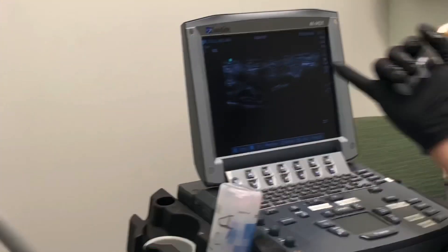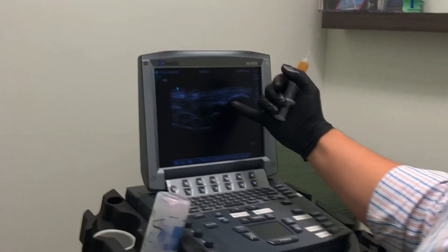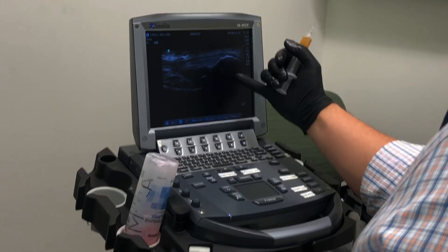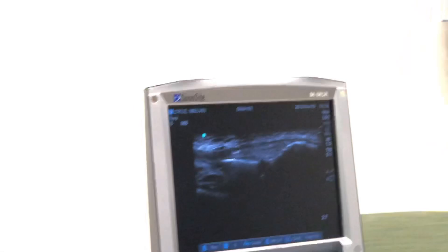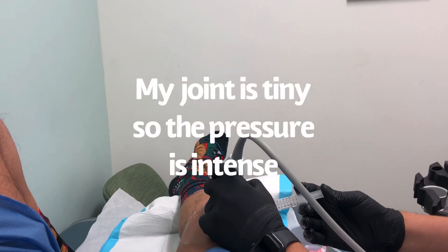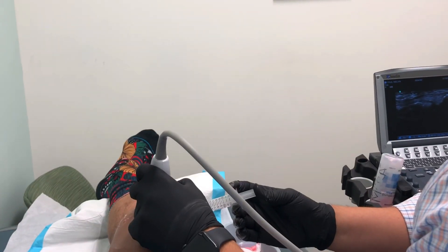There's a space right there — you can see there's some fluid in the joint. It's a little swollen today, which is probably why it's hurting me a little more than normal. That's the surface of the patella, the patella tendon right there, this is the bursa, and then there's a continuous space that goes under the patella — that's what we want. Going right below the quadriceps tendon — one shot, one kill. Slowly filling the joint with the PRP, about half of it in there.